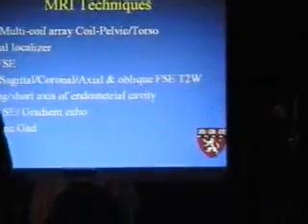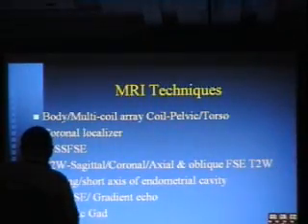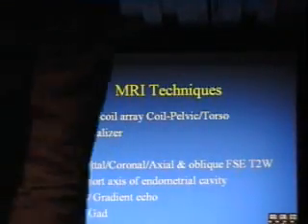Now, why do you want to do that? Well, it allows you to do the zoom lens thing, to tighten your field of view, get in close to the area of interest, and allows us to increase the signal to noise without decreasing the quality of the image. Protocol's fairly standard, nothing terribly fancy here, nothing really sophisticated.